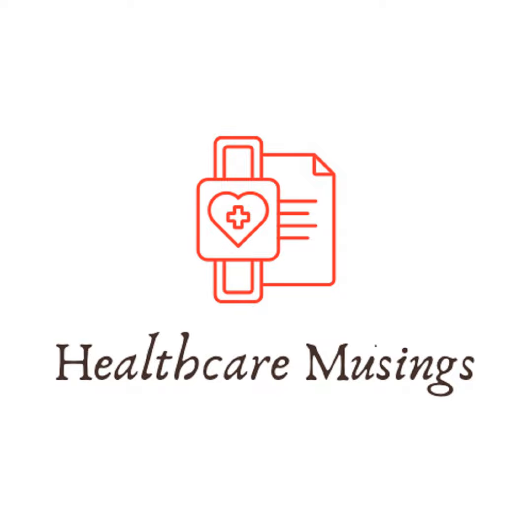In the past, there was something called continuous or controlled mandatory ventilation, CMV, which will give you whatever rate you dial, whatever tidal volume you dial, independent of the patient. Doesn't matter what the patient's doing. If the patient's wanting to breathe 50 times a minute and you dial in 20, the ventilator will give 20 breaths a minute at 500 cc, whatever you dial in, irrespective of what the patient wants. That was old CMV, right?